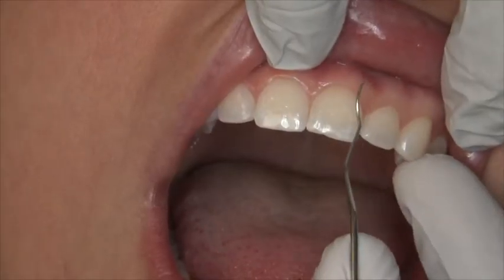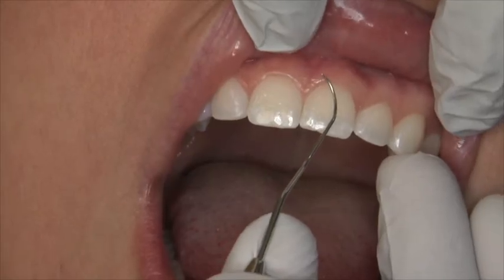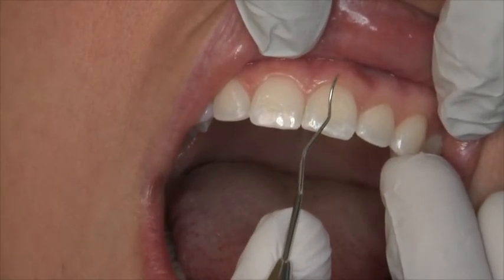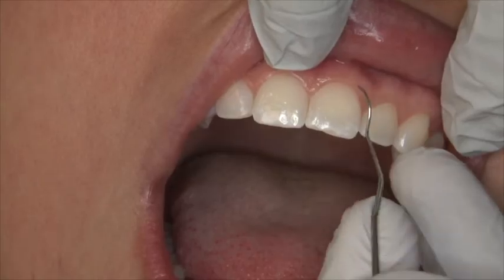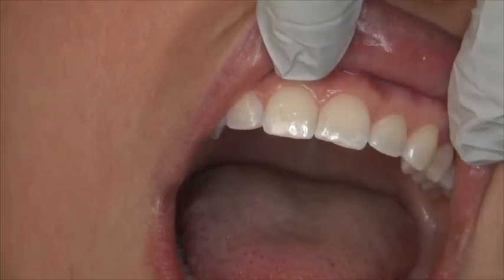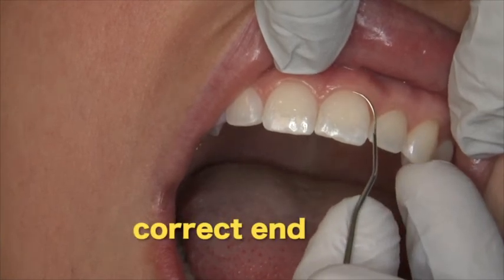To determine the correct end for anterior teeth, hold the instrument against an easily viewed tooth. The terminal shank should lie parallel to the long axis of the tooth. The tip of the ODU-1112 Explorer should wrap around the tooth and the V should not be pointing outward.